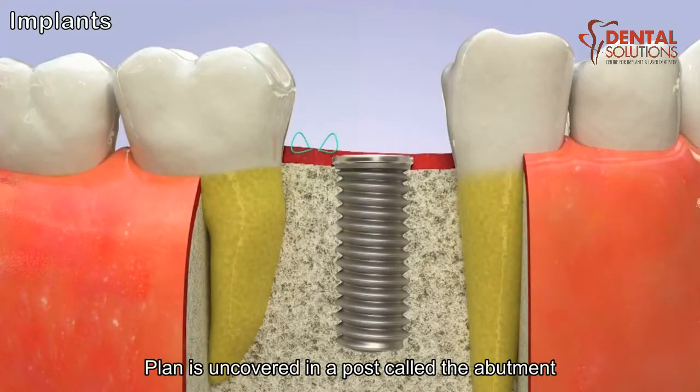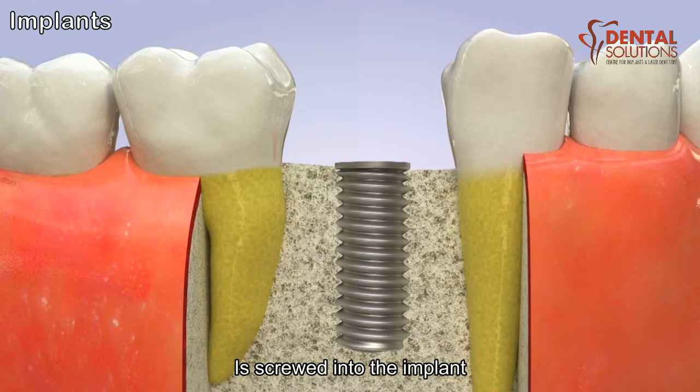Once the healing is complete, the implant is uncovered and a post, called the abutment, is screwed into the implant.